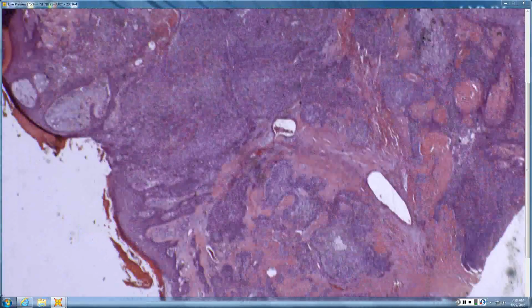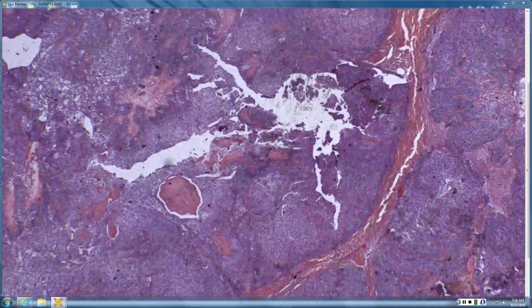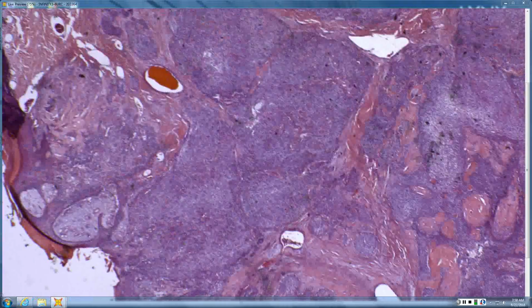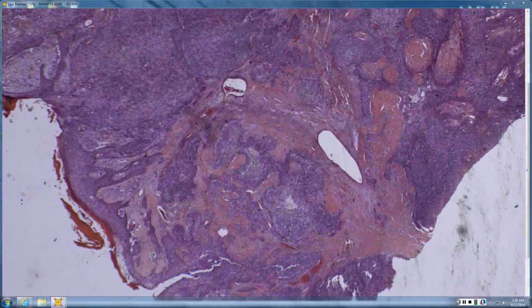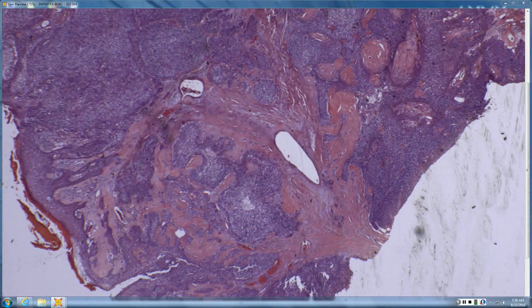You have islands of blue cells. It looks like maybe there's too many cells. They connect to the surface. I would like to go down and make sure that they don't look atypical and scary, but I'm kind of in the... Tell me about what's going on here.